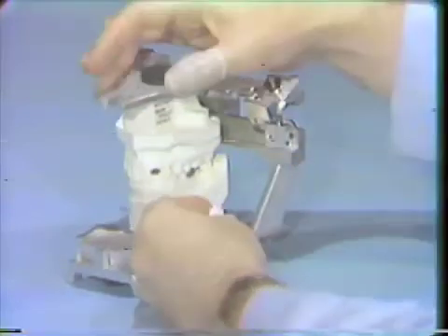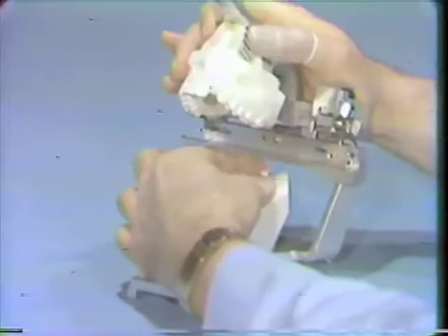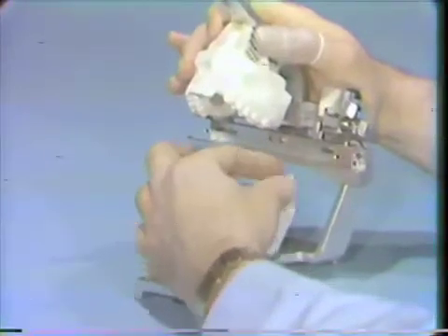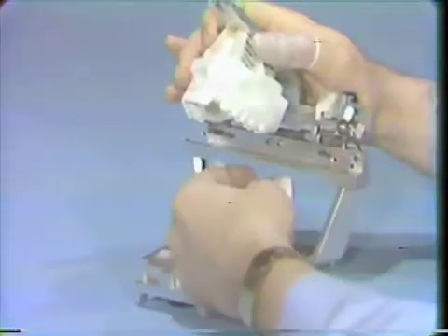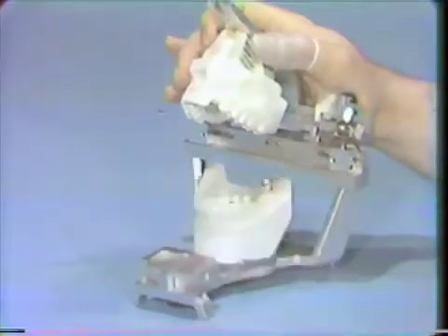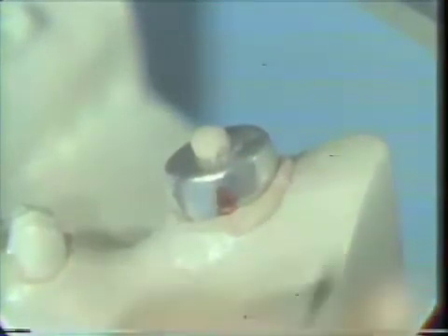However, in this instance, we'll place it on the articulator almost immediately and seat it down into place and remove the excess amount that's expressed here, and continue to seat it until we get a relatively small amount of material expressed through the opening, and remove any of the excess material that was expressed around the margin with a suitable instrument, so that the soft tissue is not subjected to any undue contact with the free monomer of the acrylic.